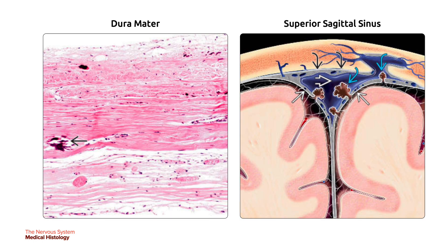On the left, the dura mater is composed of dense fibrous connective tissue; the outer and inner layers are often fused and difficult to distinguish. Non-specific calcifications can be seen, especially with increasing age. On the right, the superior sagittal sinus is a venous channel formed by the separation of the periosteal and meningeal dura layers. Arachnoid granulations in a curved blue arrow are projections of the arachnoid-covered, CSF-containing subarachnoid space into the blood-filled venous sinus.